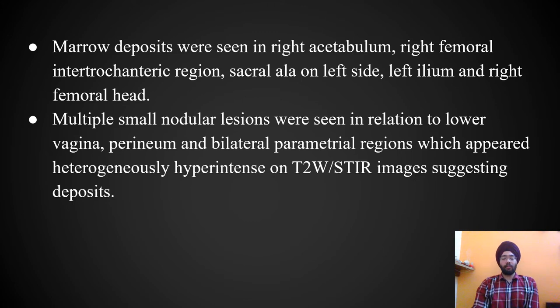Additional findings included marrow deposits seen in the right acetabulum, right femoral intertrochanteric region, sacral ala on the left side, left ilium, and right femoral head. Multiple small nodular lesions were seen in relation to the lower vagina, perineum, and bilateral parametrial regions, appearing heterogeneously hyperintense on T2 and STIR images, suggesting deposits.